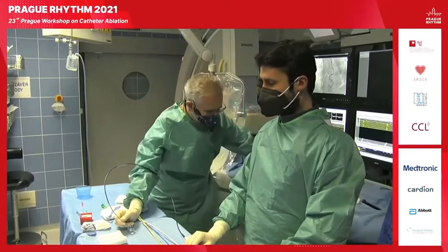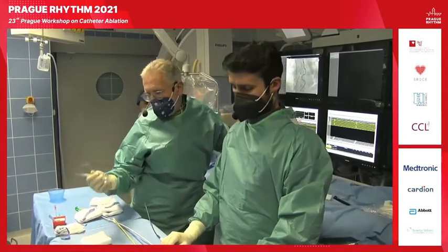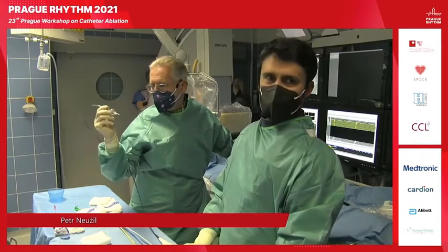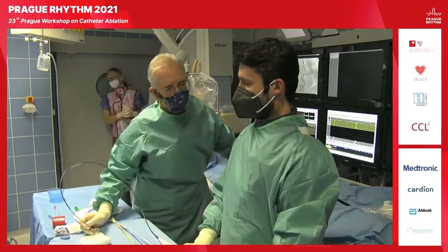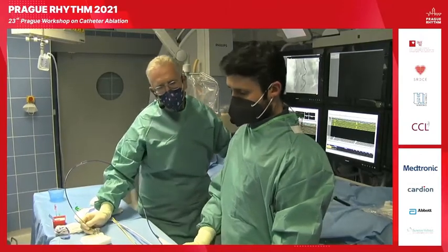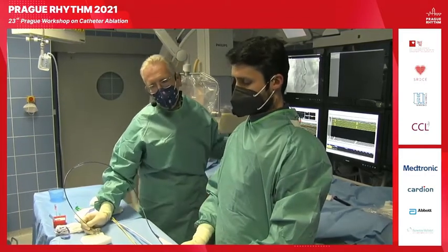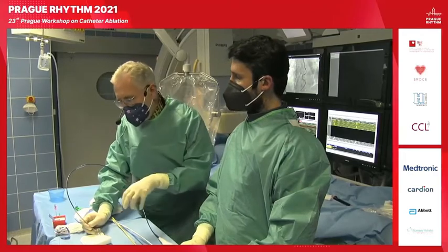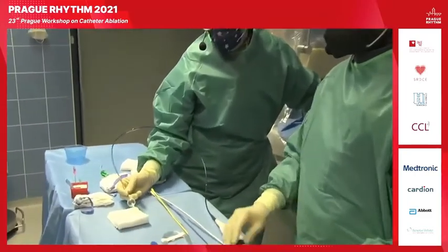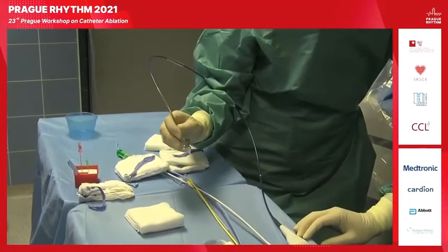So guys, we'll come in the smallest room in the world, and actually we are ready to answer the question of Joseph. He put it on just the panel. So we have right now the X3 laser. This is a technology we have had since 2004, I believe, and since 2009 the company involved a highly compliant balloon, and this catheter itself, X3, is available in Europe since 2018.